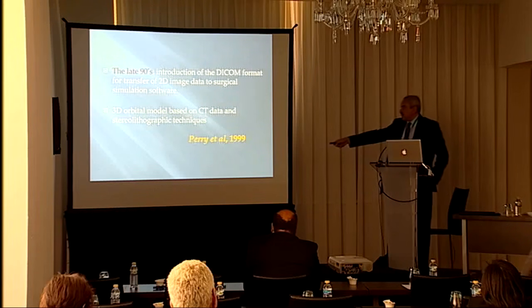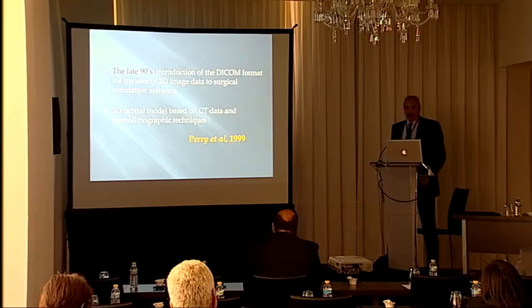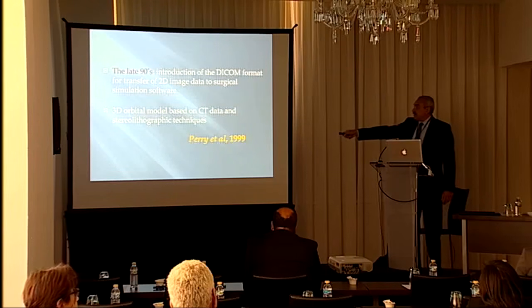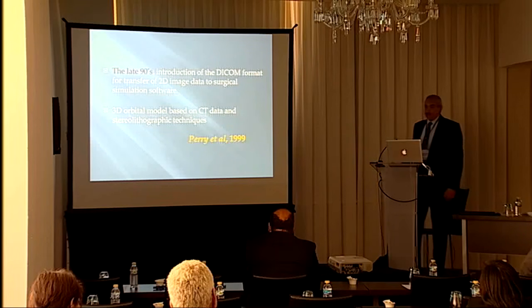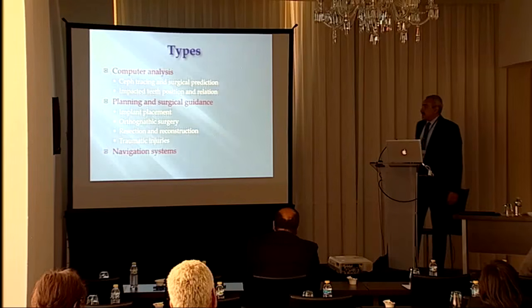And the study of Perry et al. actually pulled the attention of the whole medical industry to the abilities of 3D modeling. He made a 3D orbital model based on the CT scan data of patients with trauma mainly, and even with tumors, and made a 3D model of the orbit and the orbital floor to customize fixation devices and meshes.